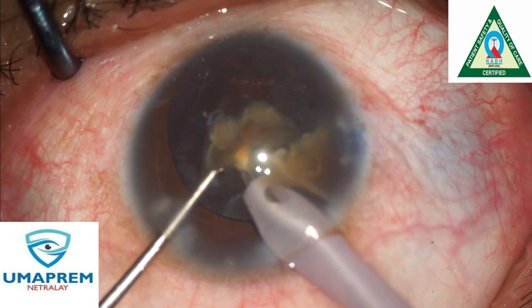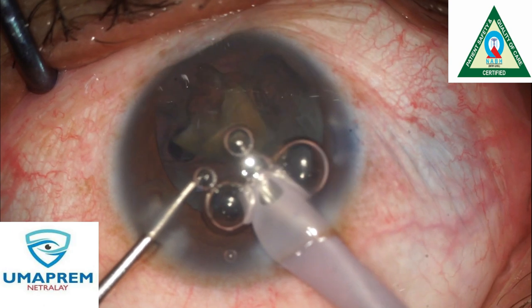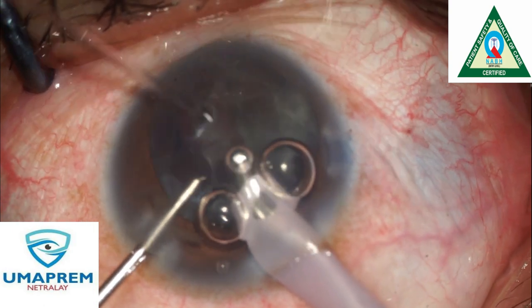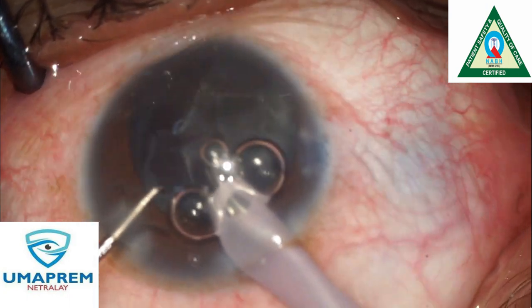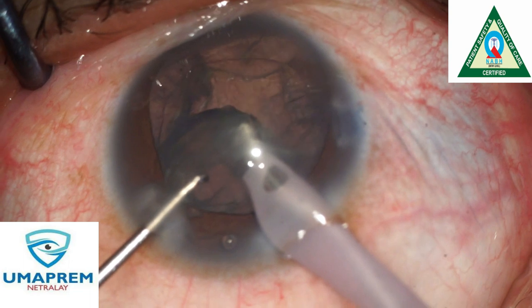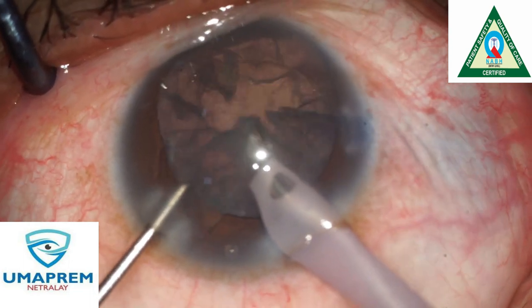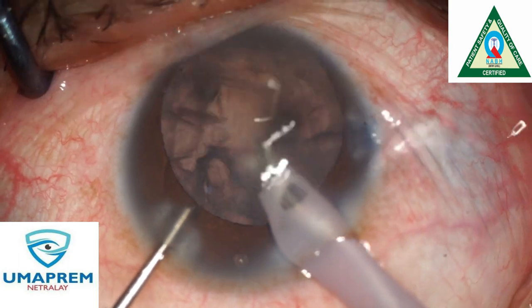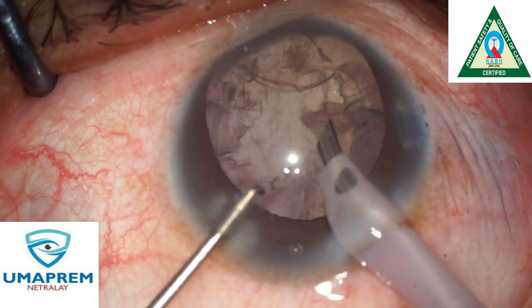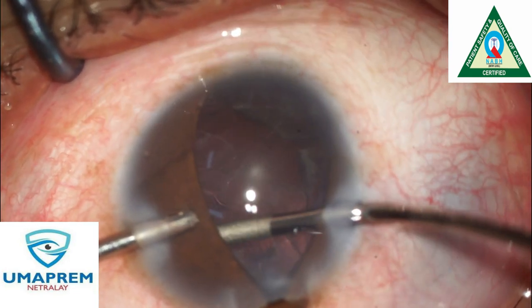Very gently, we emulsify the nuclear fragments one by one. After emulsification of each nuclear fragment, we aspirate the epinuclear plate in a very controlled manner.